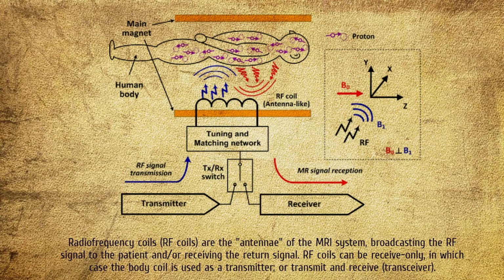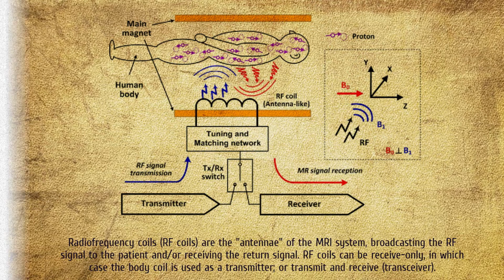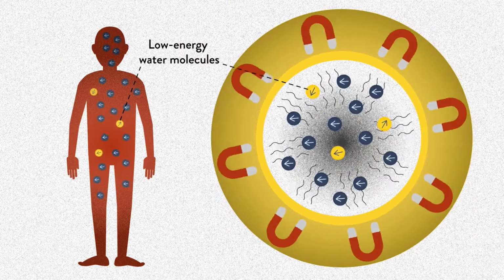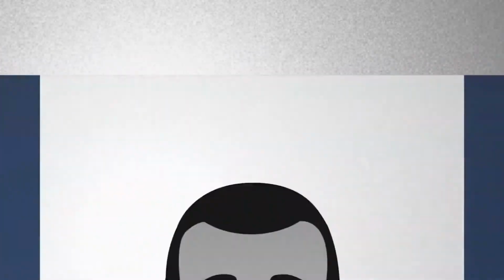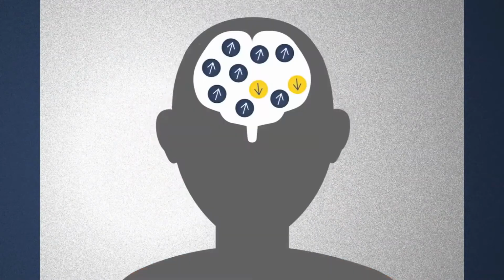Although these electromagnetic fields are in the RF range of tens of megahertz, often in the shortwave radio portion of the electromagnetic spectrum, at powers usually exceeding the highest powers used by amateur radio, there is very little RF interference produced by the MRI machine. The reason for this is that the MRI is not a radio transmitter.